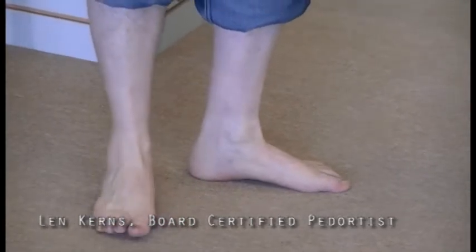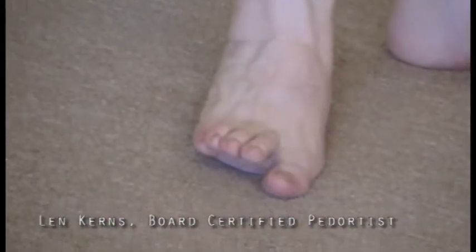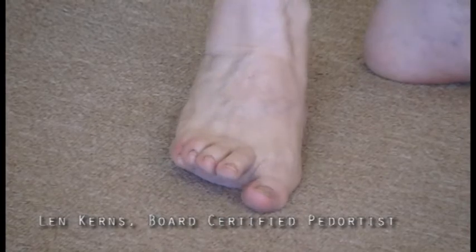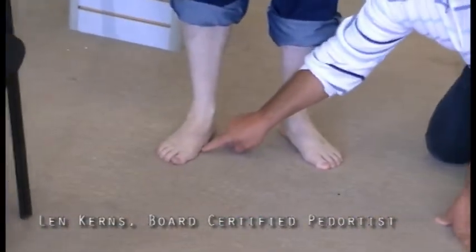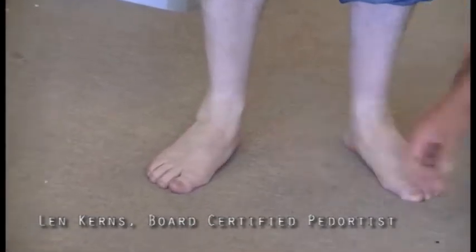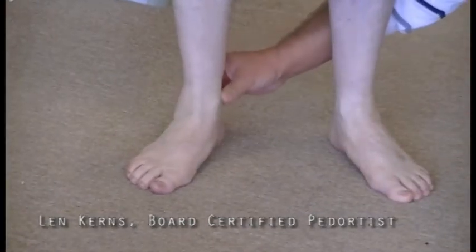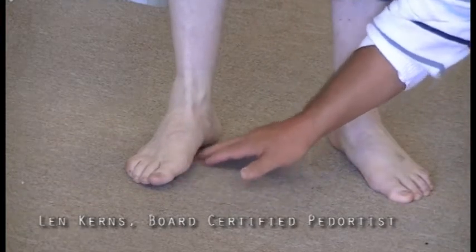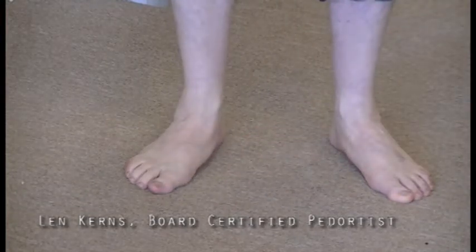And back down. Bring it down. There's the pronation. That is his norm. So if you stand natural for a minute, face the camera. Right here, you can see the full pronation of his foot. And if he was to rotate his foot up a little bit, that's neutral. This is where the casting should be taking place once we do the casting.